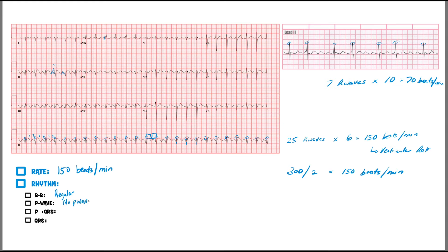No P wave — go to V1. In lead 2 we have these spiky sawtooth-looking parts. In V1, I see a sawtooth structure followed by a QRS complex, then another sawtooth, then a QRS. In lead 2, same thing — sawtooth then QRS. Checking leads 3 and AVF as well — same sawtooth pattern. Anytime you see a P wave that looks like a sawtooth, that should clue you in that this might be atrial flutter.